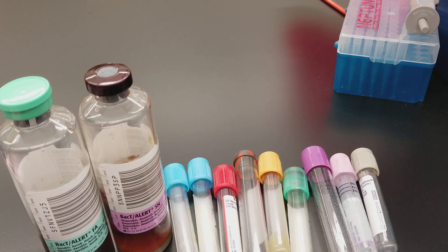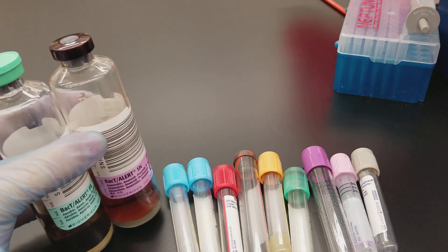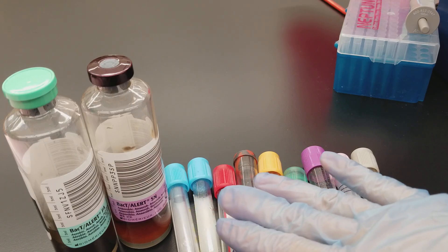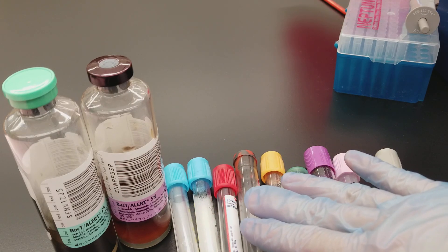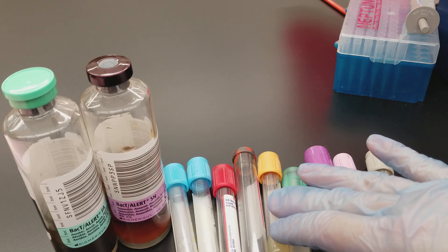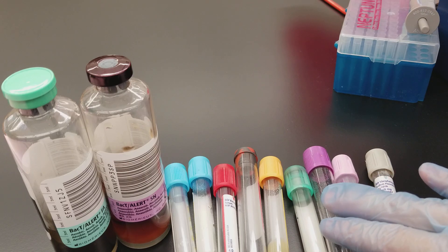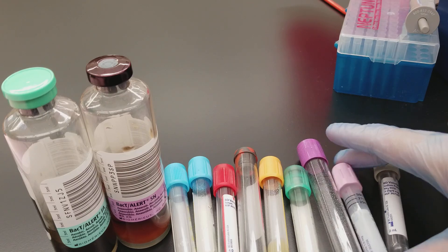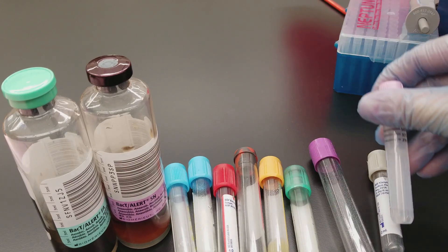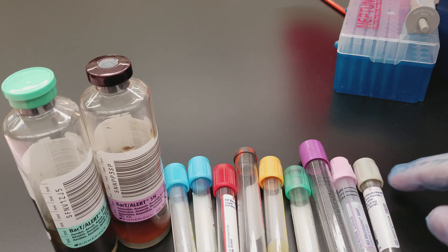The blood culture bottles don't have to be aerobic and then anaerobic, but they're just there to show you what's going on with them. Then it's the light blue, red — this is considered basically an SST tube as well. The SST, which is the gold, the lithium heparin, the potassium EDTA — these are two tubes. This is actually a bullet; you can see there's a smaller tube inside a really large one. And then there's the gray top tube.